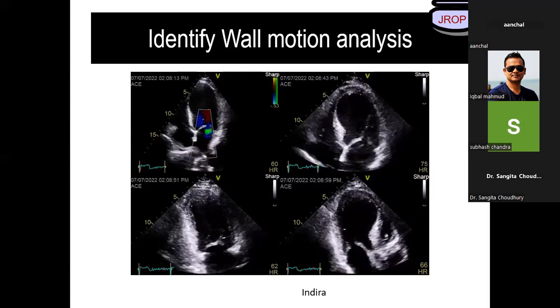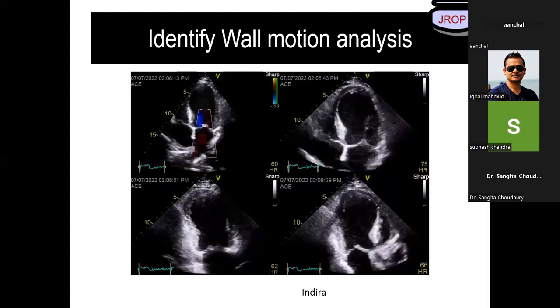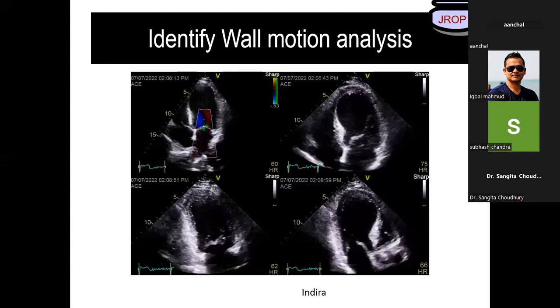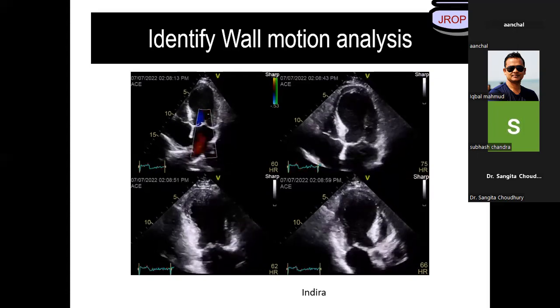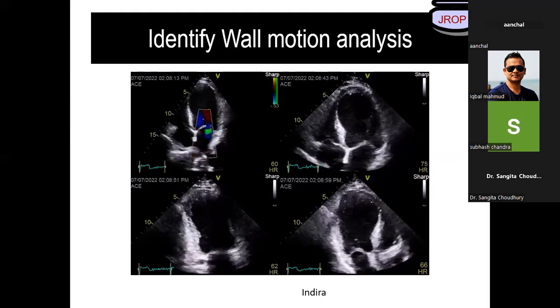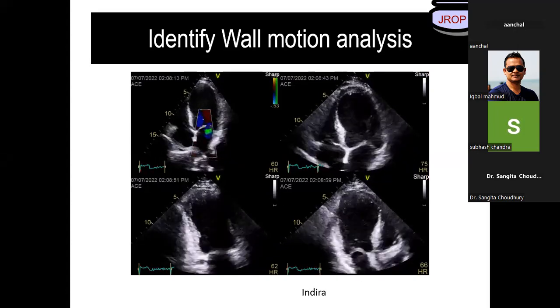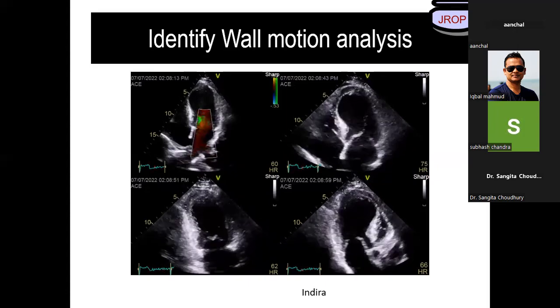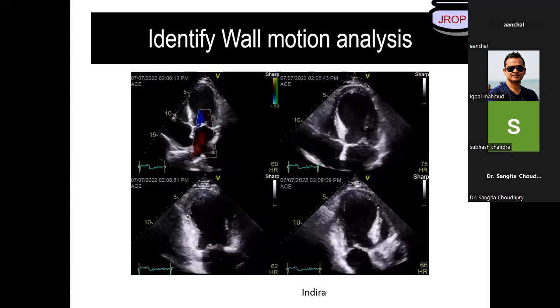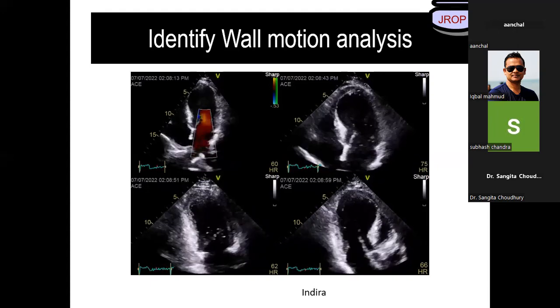Sir, can I see, sir? Wait a minute. Ashok, you want to say something? Why old infarct, Birata? I say it's acute infarct, immediate infarct. When I was taking classes, I was telling you why. Birata, would you like to take up this question? Because you said old infarct, I said okay, it's old infarct. Why is it old infarct? Why not new infarct? Sir, the exact answer I don't know, sir.